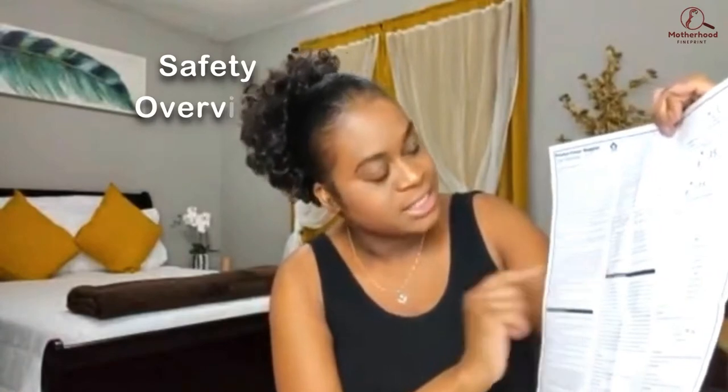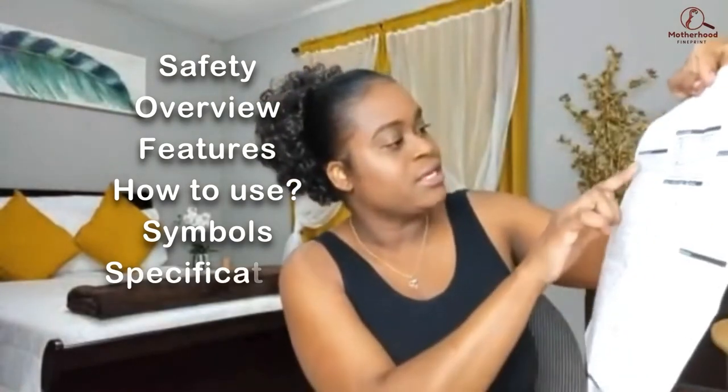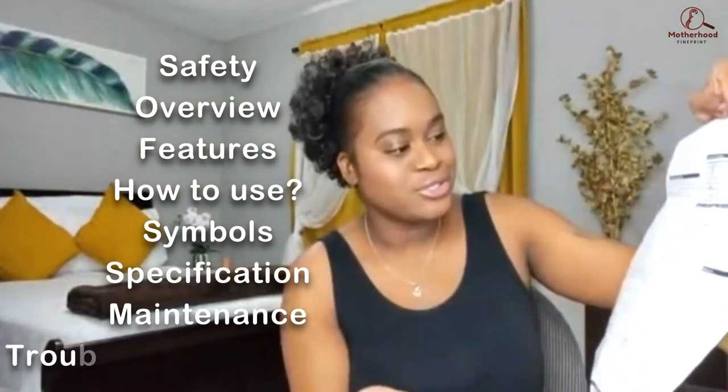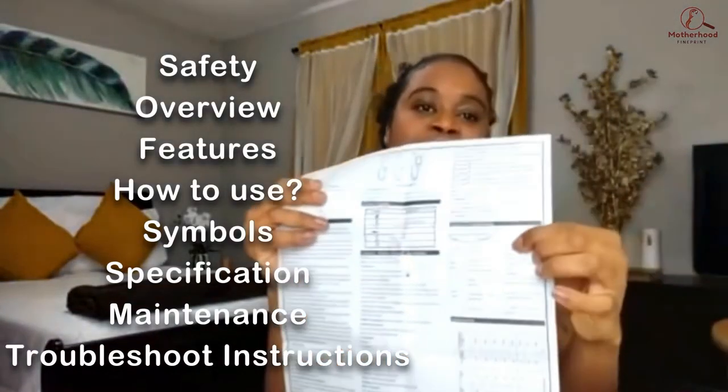Now we're going to go ahead and open up the box and I'll show you guys everything that comes inside. First, you have two manuals — one is English and the other one is French. Once you open up the manual you'll see different sections: the safety section, introductions, buttons and display features, how to use the device, specifications, maintenance, and ways to troubleshoot.